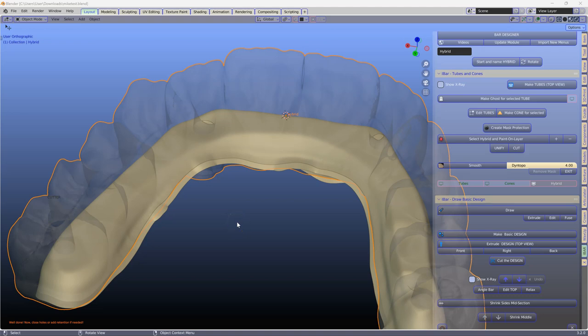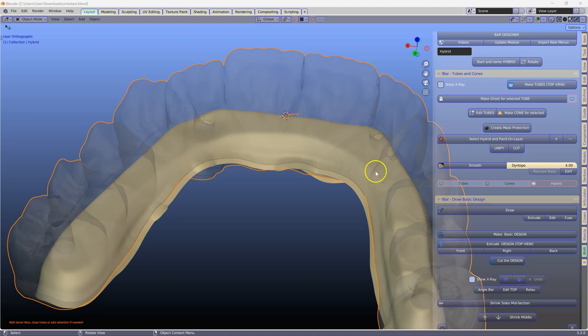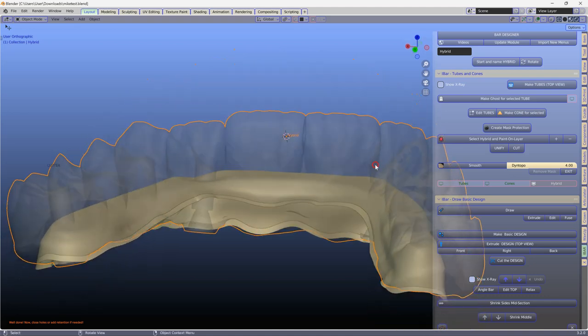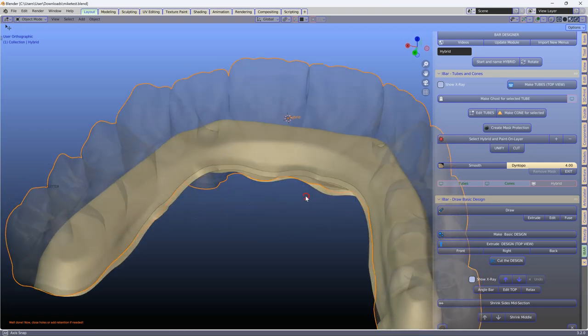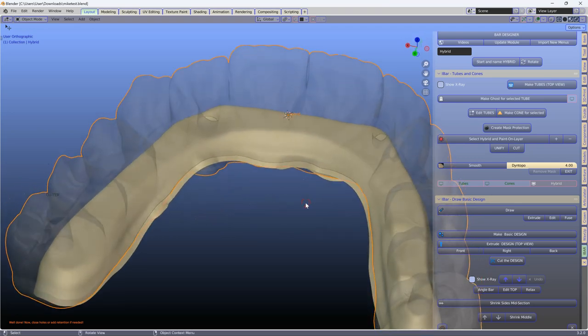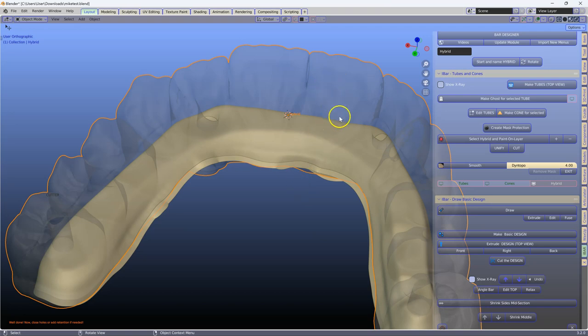The problem with this i-bar is that once it was separated, the holes were blocked in the actual bar itself. So we need to have a look and analyze the mesh structure of this hybrid.